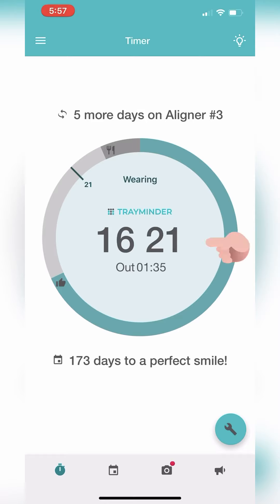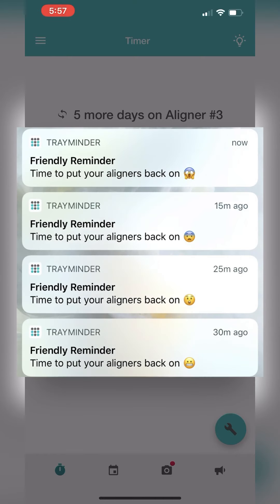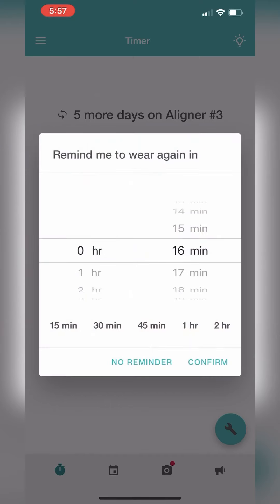When you take your trays out to eat, tap the inside of the circle and select the number of minutes before you want to receive a notification to remind you to put your trays back on. You can choose 15, 30, 45 minutes, an hour, two hours, or any custom amount of time. If you forget or ignore the reminder, don't worry — you'll get multiple notifications. If you don't want a notification, just tap no reminder.